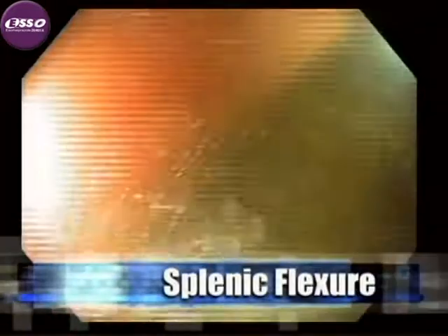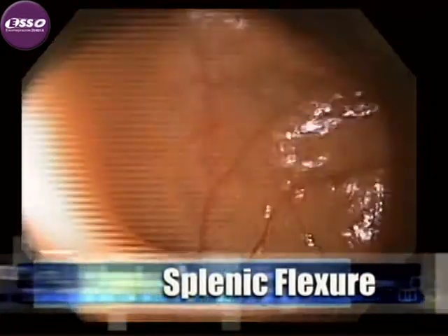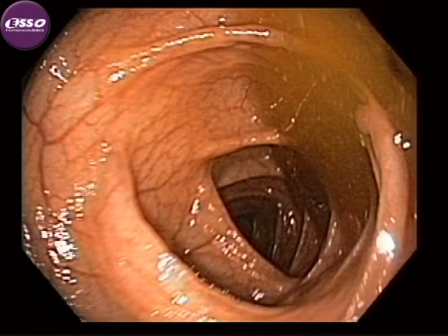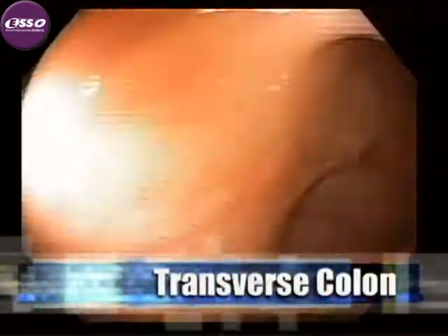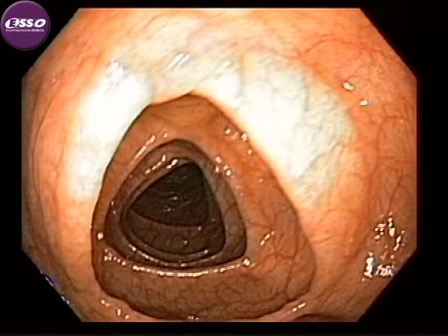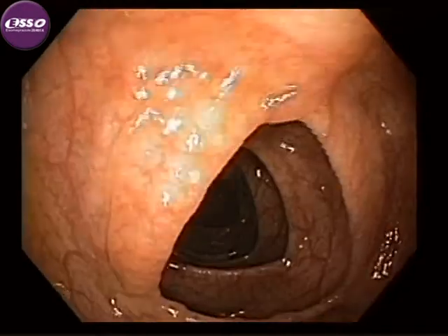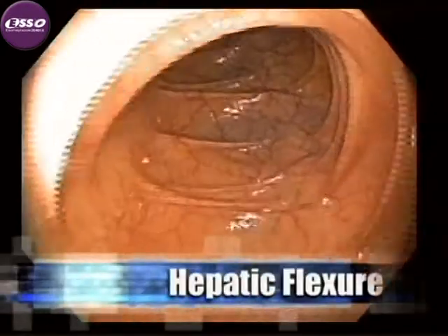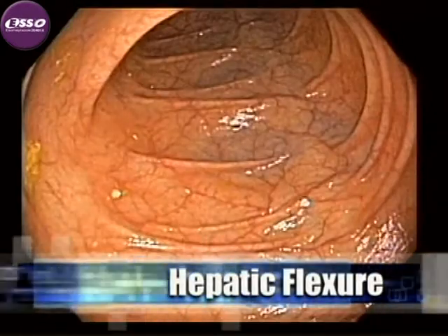With the patient in the left lateral decubitus position, the splenic flexure is often marked by a pool of fluid and a sharp angle. The transverse colon tends to be triangular, and because of its anterior location, light transmission through the abdominal wall and light moving across the upper abdomen with scope movement is a good clue. The hepatic flexure is often notable for the bluish color created by the liver on the opposite side of the bowel wall and its location adjacent to the ascending colon.